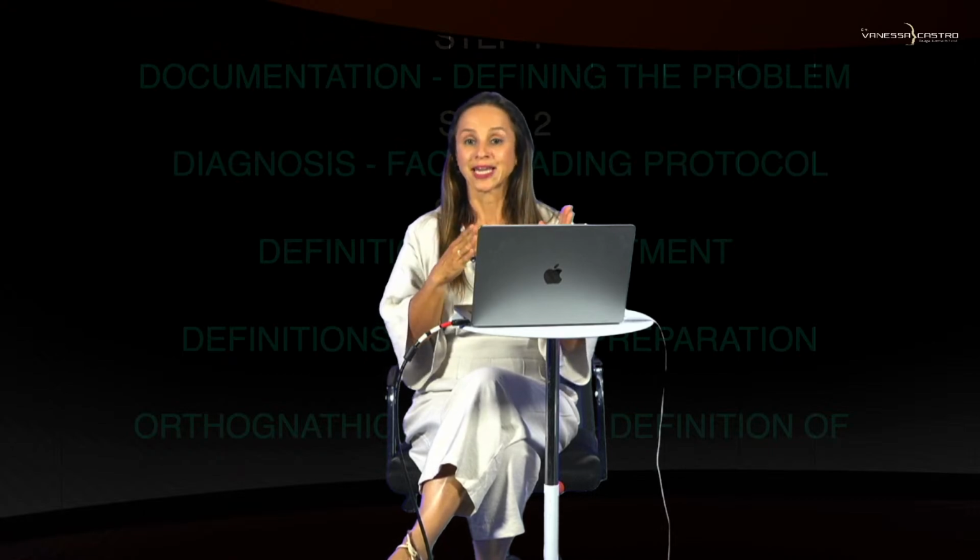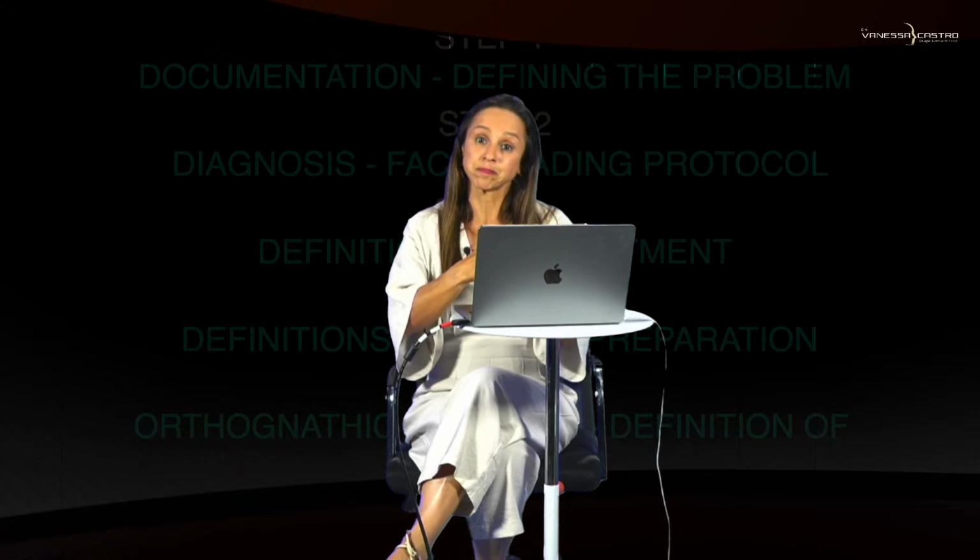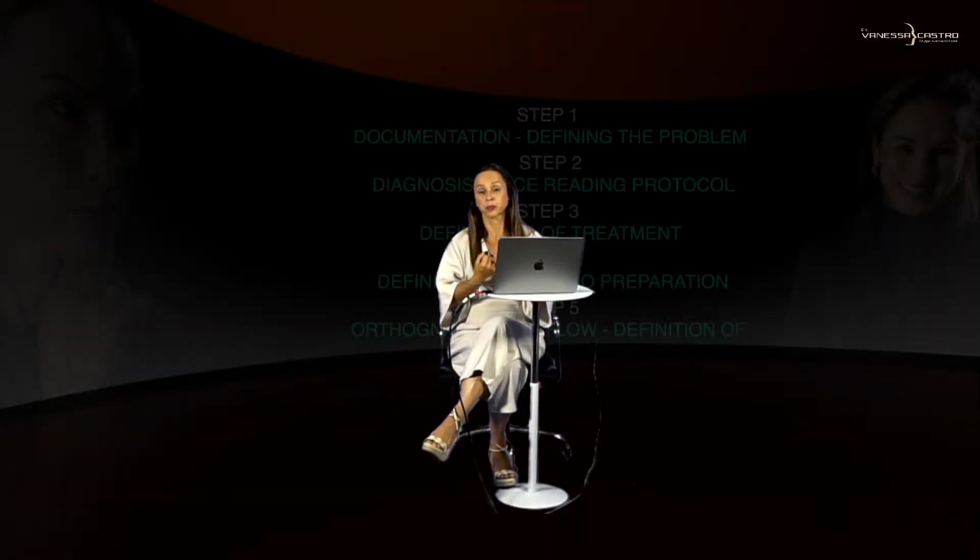So I will compare the shape, the morphology, and I will compare in a couple months what happened with that condyles. If I have hyperplasia condyle, I have some characteristics that I need to understand. The length of the condyle, the size of the condyle, the symptoms of the patient.